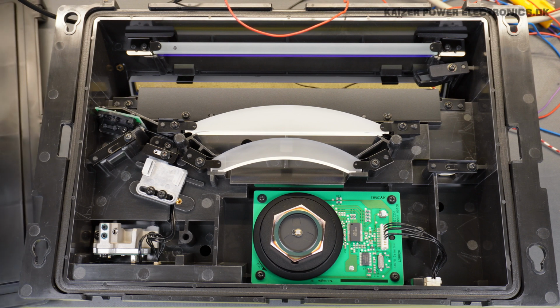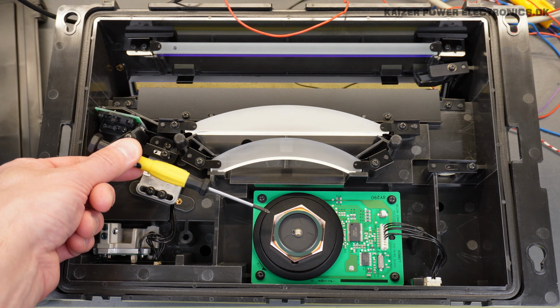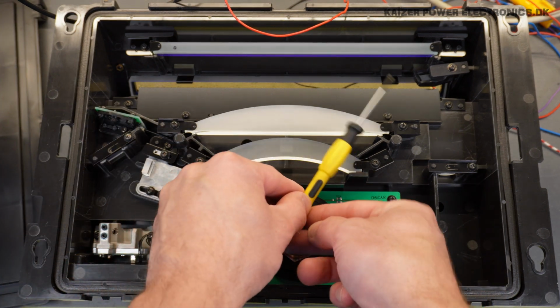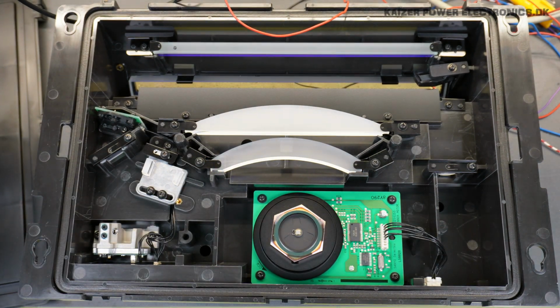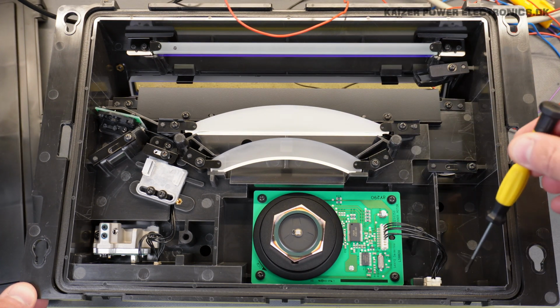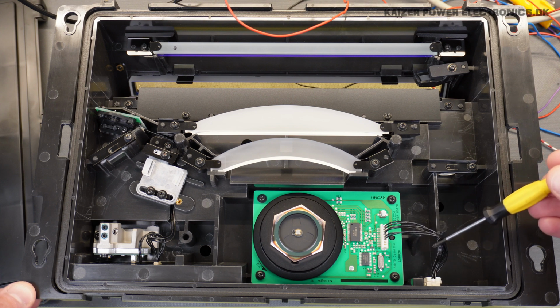So what is going on down here? We have our laser diode sitting over here. We have some kind of measurement device next to the laser diode driver, so that's a feedback. The beam goes up through this glass, mirrors in through these two lenses onto the scanner motor, which then reflects it out all along these lines. By all the mirrors and lenses, that's what we see through the output. Now over here there is some other lens, and this is the reflection measurement that I talked about on the right PCB on the scanner motor board.